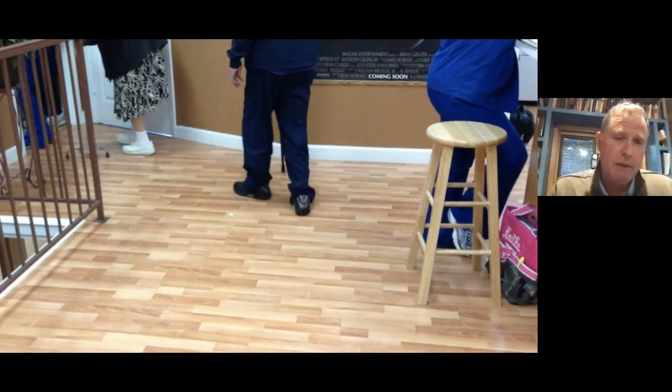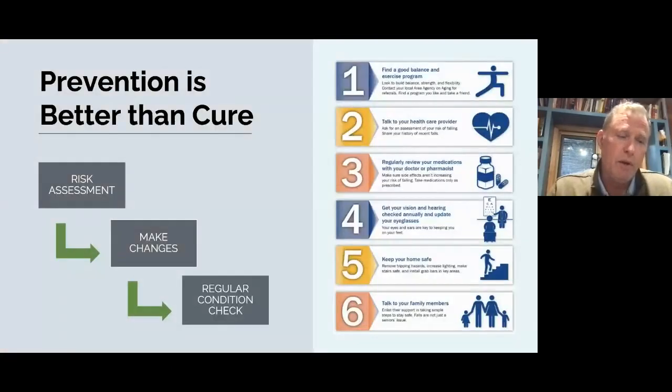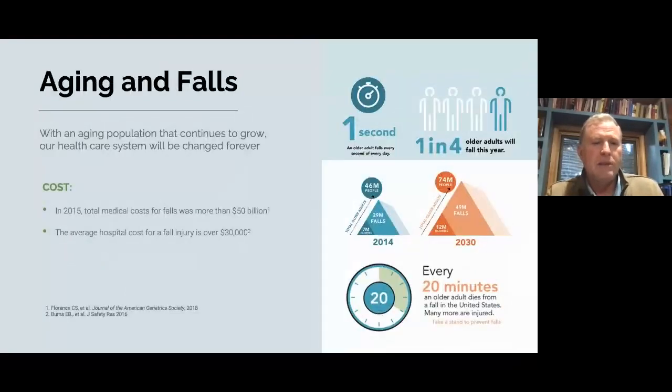This is my office, and it's a chain of people using assistive devices, and your office is probably the same. You'd be shocked at how many patients really could benefit from just a balance assessment and really just talking to them about tools that are available to them. There's probably way more than you think. And just watching these patients walk, watching and identifying abnormal gait is really a critical piece. So again, prevention is better than the cure, risk assessment, making changes, and there's lots of ways to do that.